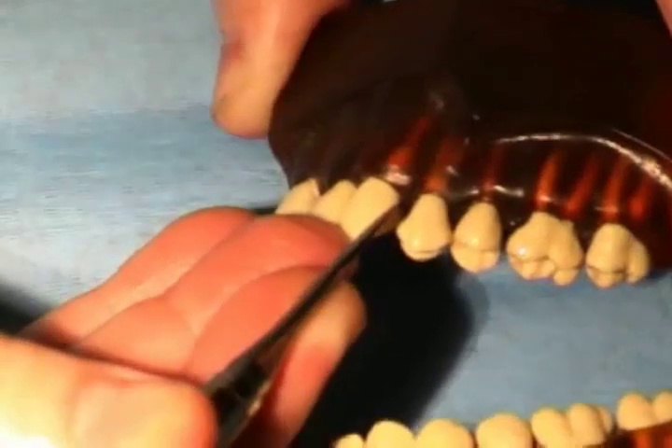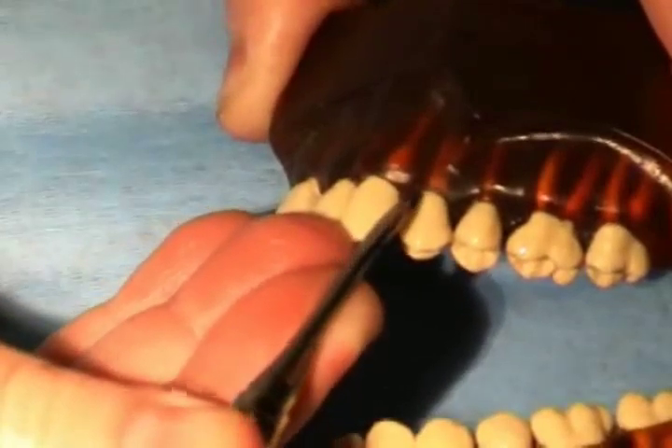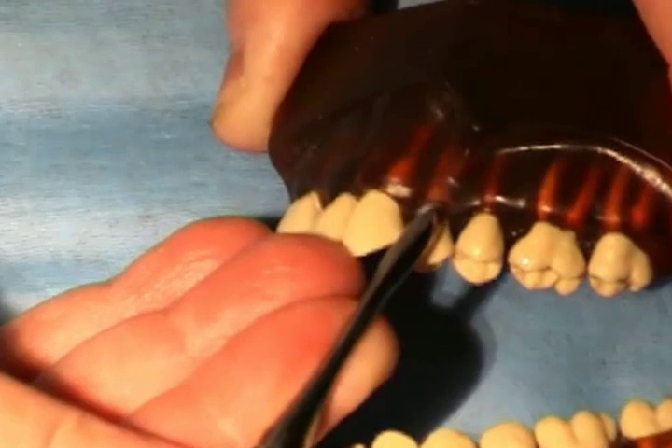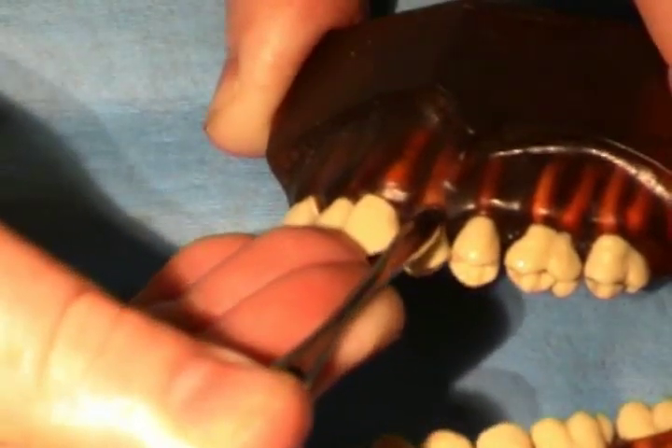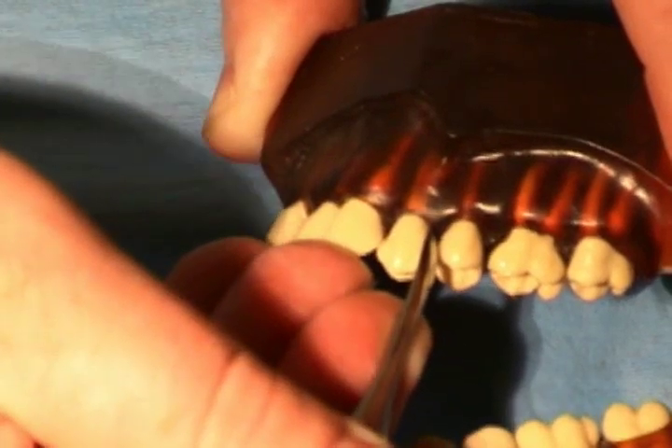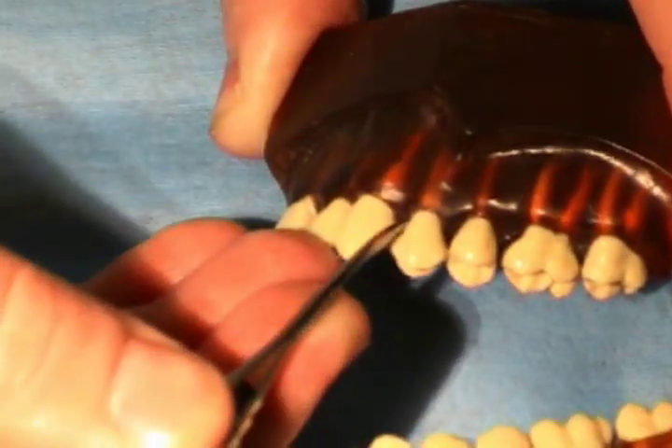First, a periosteal elevator is used to break the gingival fibers so that the forceps can be placed below the CEJ. This is done all around the periphery of the tooth to be extracted. It is usually easiest to do with the smaller end of the periosteal elevator.